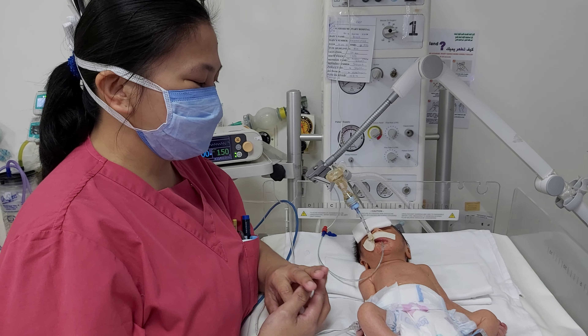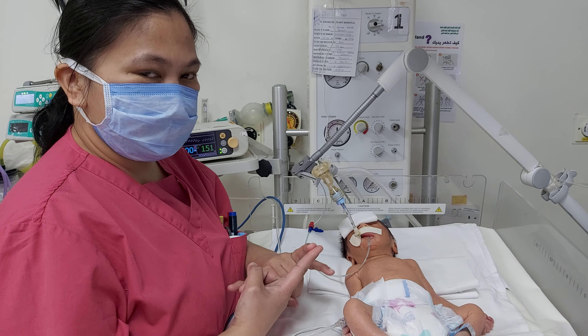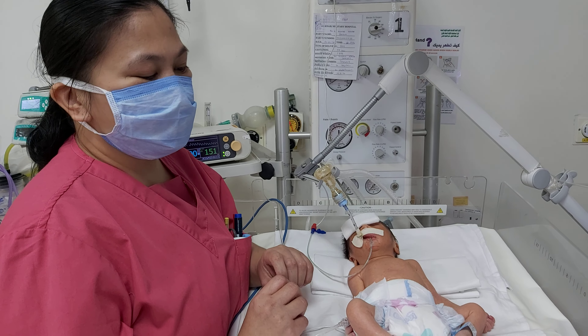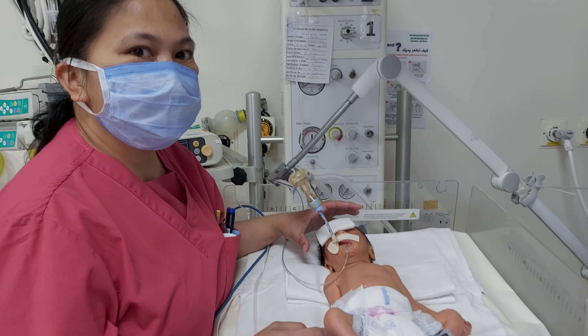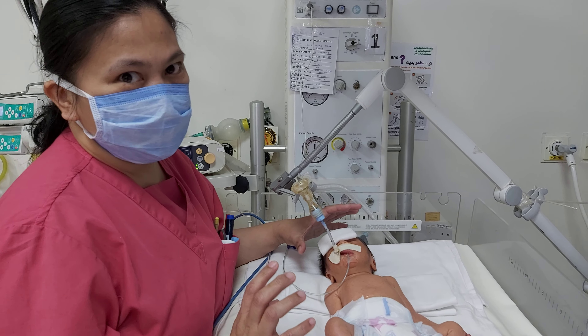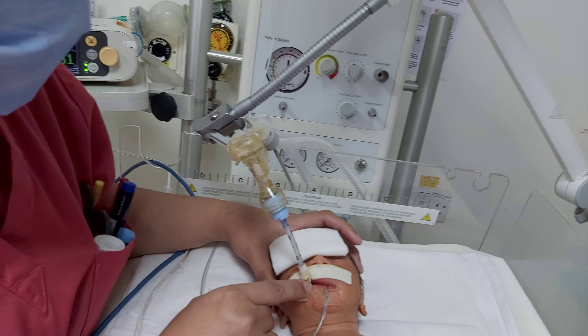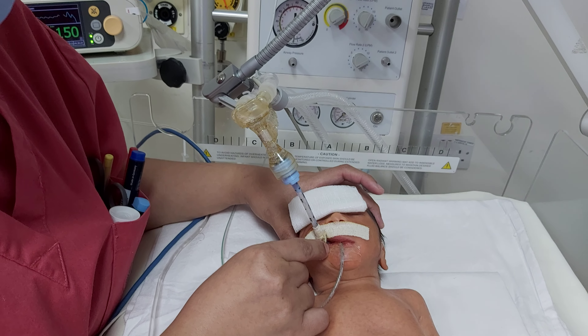The first one is the tip-to-lip distance. We have to know the weight of the patient in kilograms and then add 6 cm. So with this patient, who is weighing 2 kilograms, we add 6, so it becomes 8 cm. We will place the ETT at the 8 cm mark on the lip of the patient.